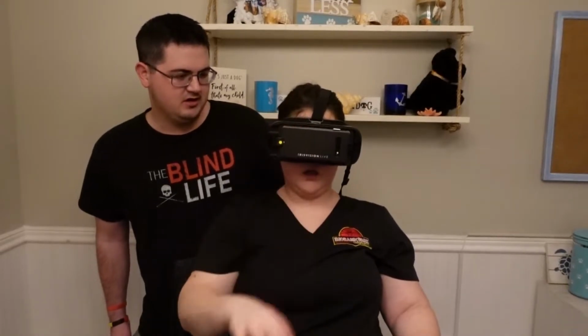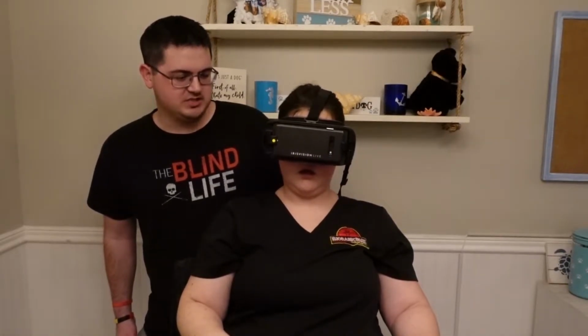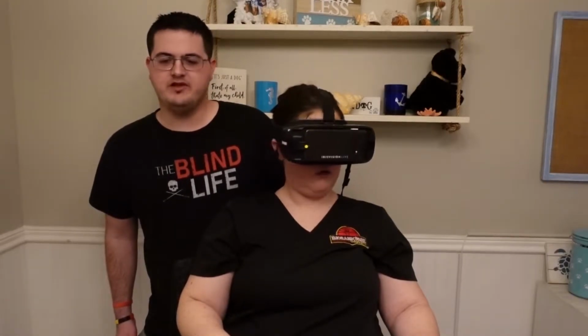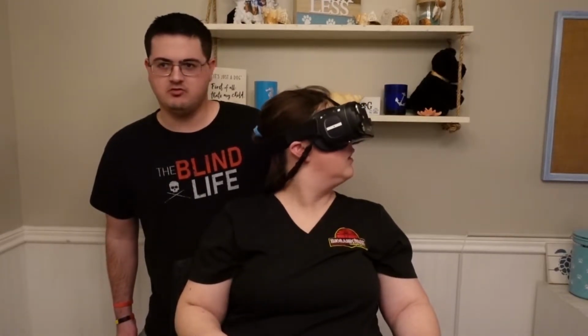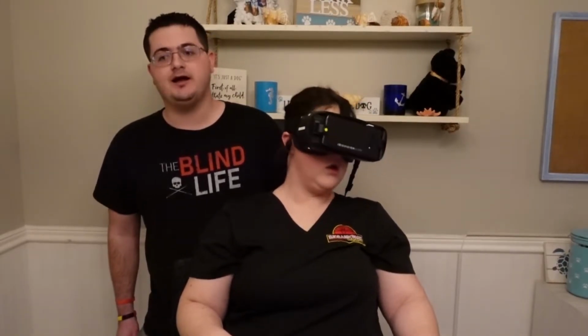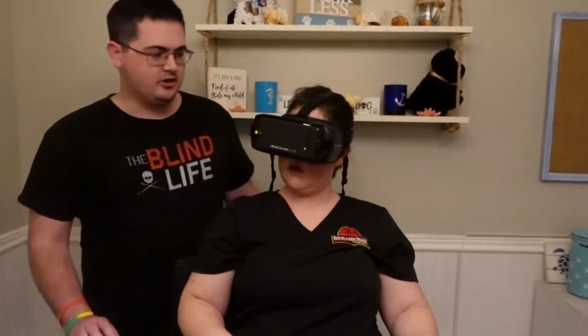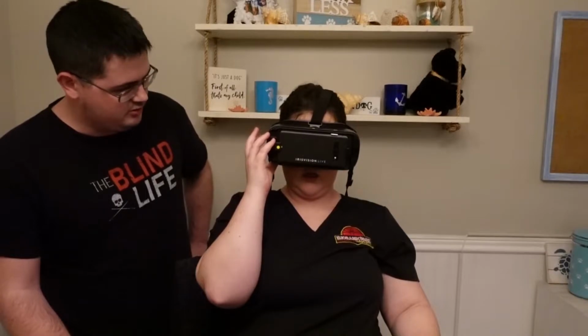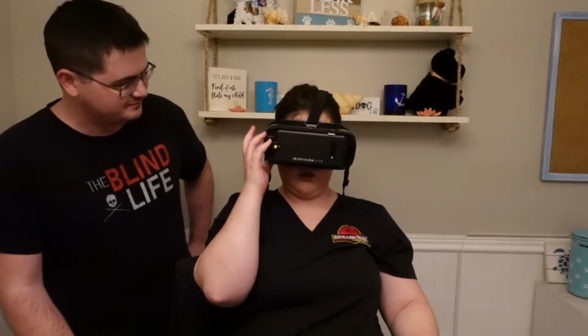But other people still have more field of vision. It depends. Like for me, I'm less than, I think, 10 degrees of my field of vision, so I don't see a lot at all. Versus someone like Kirsch, who still has a lot, this is probably very eye-opening for her.